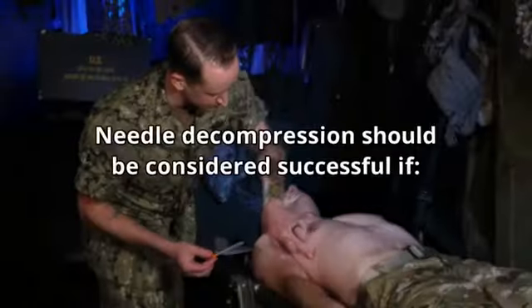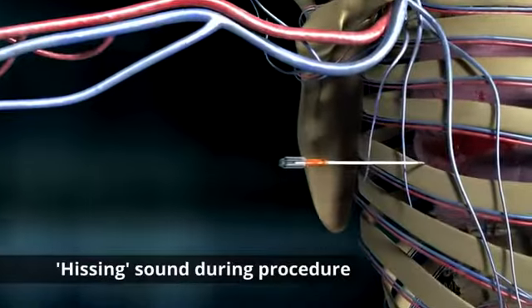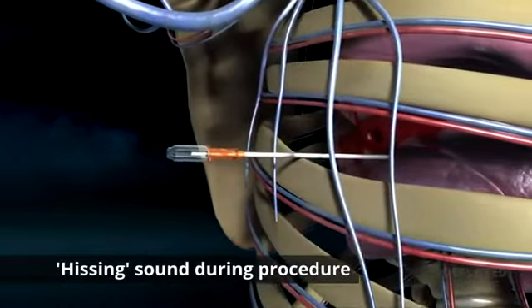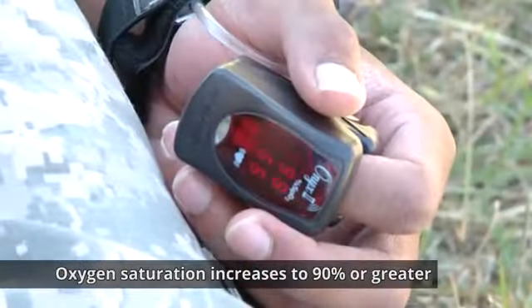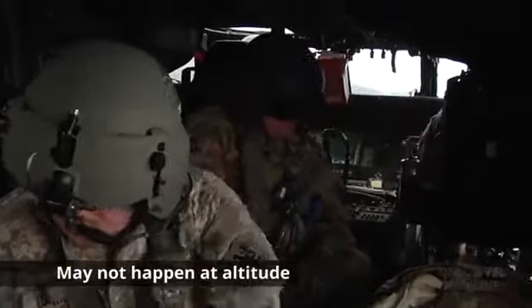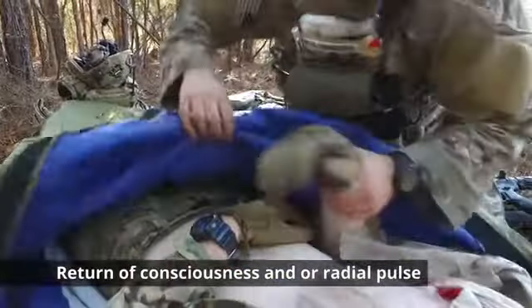The NDC should be considered successful if respiratory distress improves or there is an obvious hissing sound as air escapes from the chest when NDC is performed. This may be difficult to appreciate in high noise environments. Success is also indicated if hemoglobin oxygen saturation increases to 90% or greater. Note that this may take several minutes and may not happen at altitude. A casualty with no vital signs has returned to consciousness and/or radial pulse.